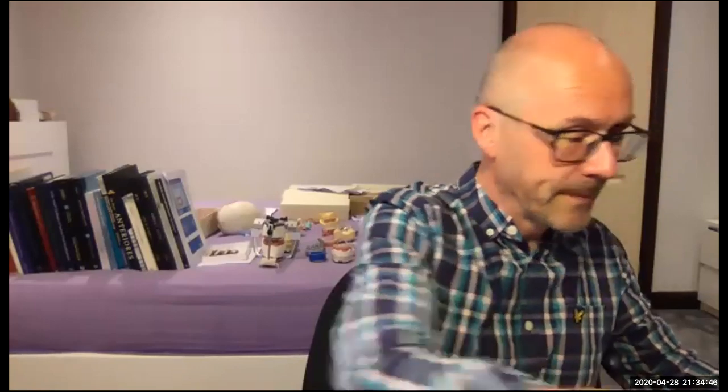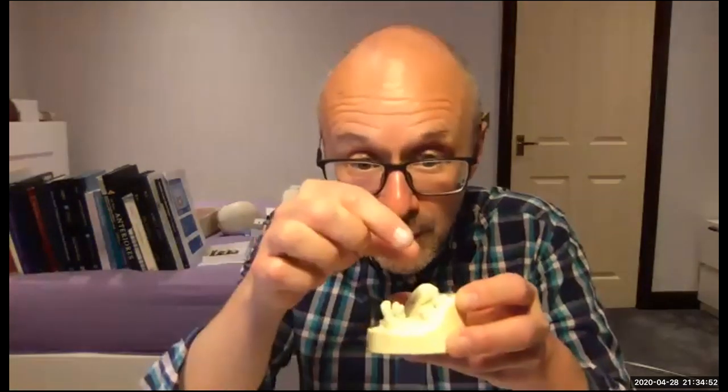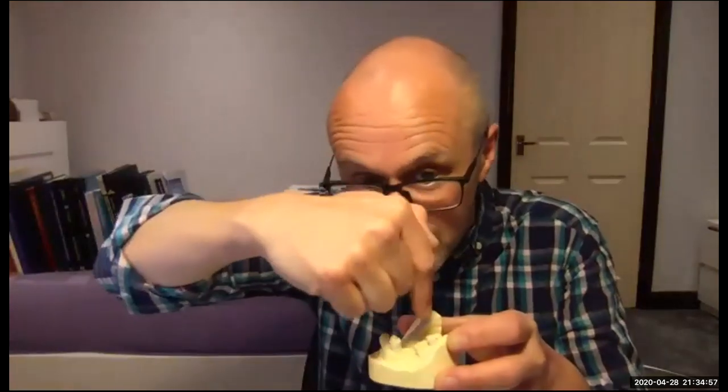I did a talk yesterday, which you may not have caught, but I showed an immediate case. And quite often, Rowan will make me prep guides if I really need to be precise, and they're like little Duralay hats that we put onto the model, just fit over the teeth. A bit of the tooth that I need to cut off just sticks out, so I can then do a nice little odontoplasty, and it's just like for fixed pros.